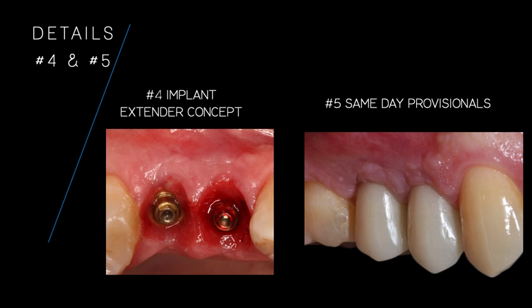This is huge. This will modify your practice. This will make it a lot easier because you're ensuring several things here. You're ensuring a soft tissue attachment, even bone integration, many times. But most of all, you're ensuring the best soft tissue attachment that you can have, because soft tissues will attach to the surface of this intermediate abutment, and you will bring your finish line to the gingival level. So you're looking at the abutments, you're not looking at the implant's connection.